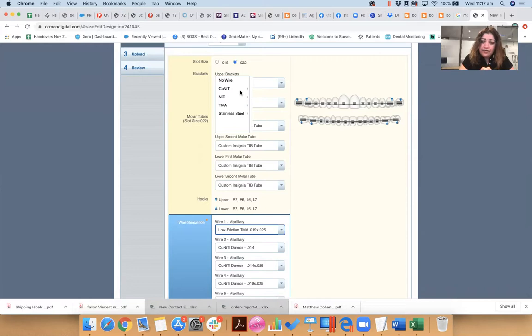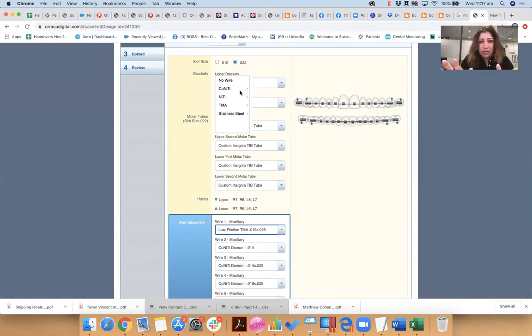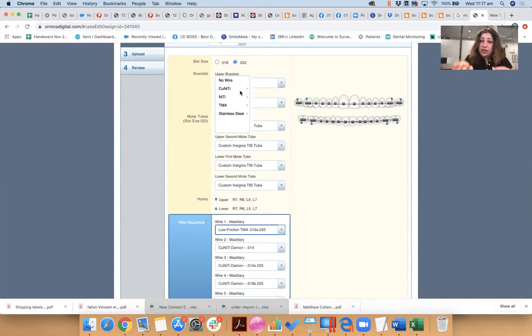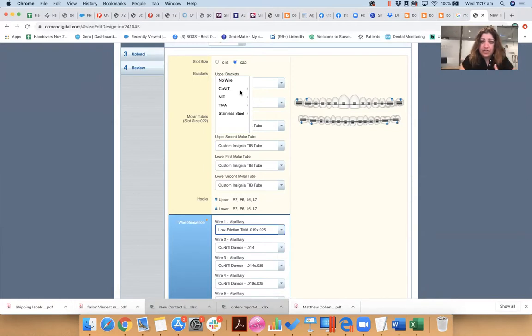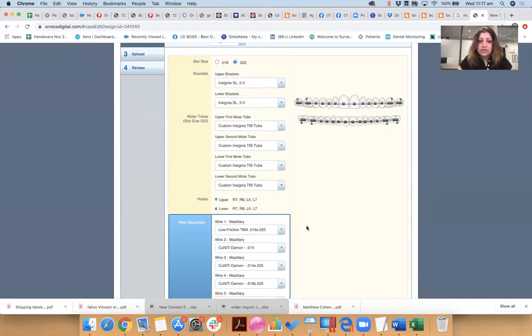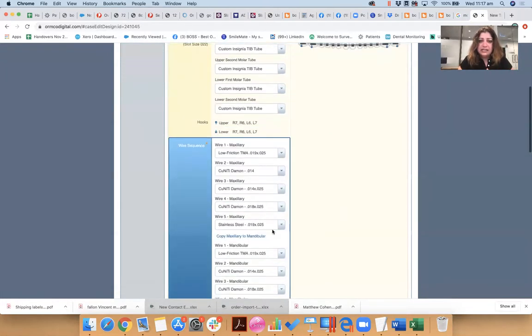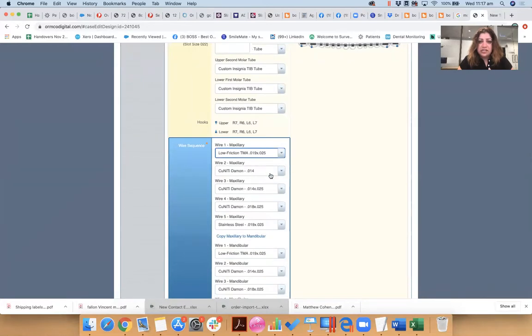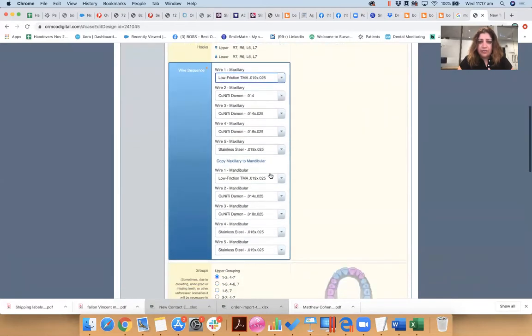Okay, if it's a Class I case, for example, with mild crowding or moderate crowding, you might just want to have some round wires customized and then some rectangular as you go through treatment. But if you've got a Class III case, you might not want any rectangular wires for the lower arch, right? Really, really depends on your treatment objectives.